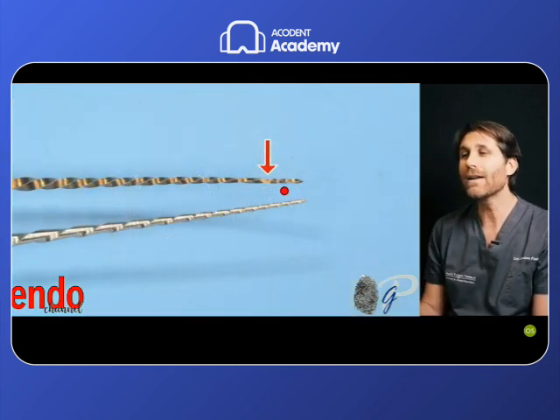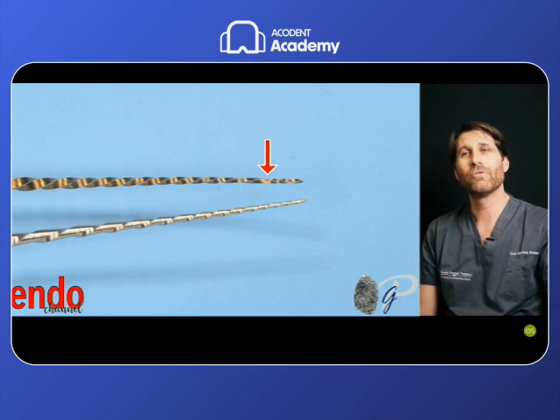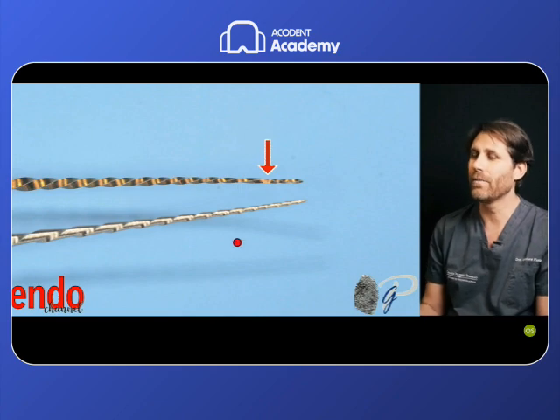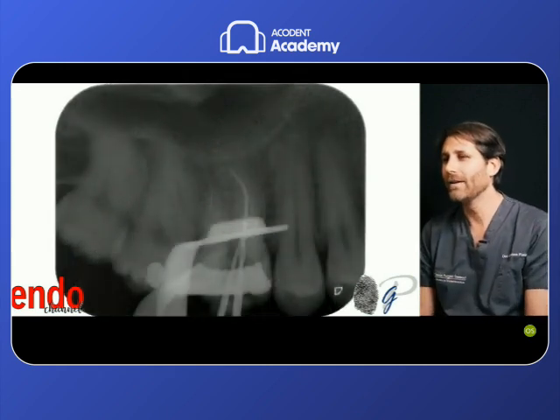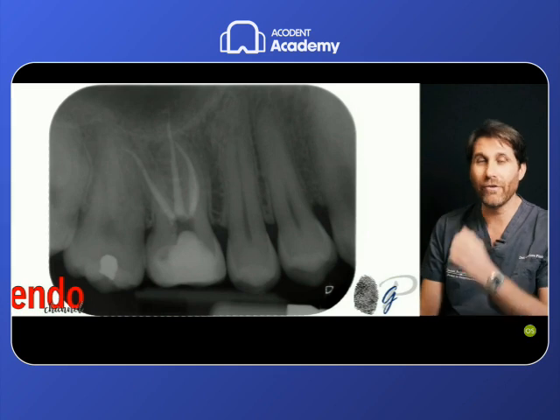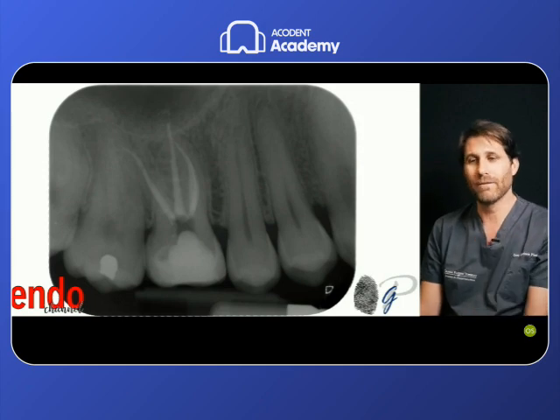The Gold Glider again deformed because of its lower resistance to torsion given by the metal treatment, the martensitic file, and the less cutting ability. While in the same canal, the AirPilot was going towards the apical third like this in this double curvature. And those are the MB1 and MB2 after the preparation and after the filling. So this is my instrument of choice, and I am demonstrating to you why it works better than others.